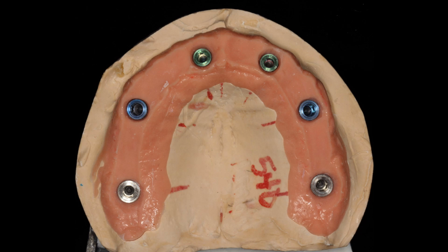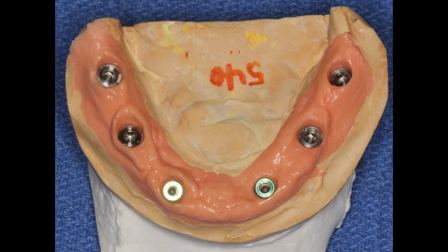This is what we call the master cast. It shows us the soft tissues and the implants on one model that should be as close to perfectly like the mouth as we can get it. That's the key here, is that these master casts need to be made with care and then verified at a future visit, so that when we make the final prosthesis, especially those in zirconium, they have to fit each implant perfectly. And that might sound easy to you, but making a glass type prosthesis fit 6 implants or more perfectly and passively takes precision and care. This is the lower arch master cast.